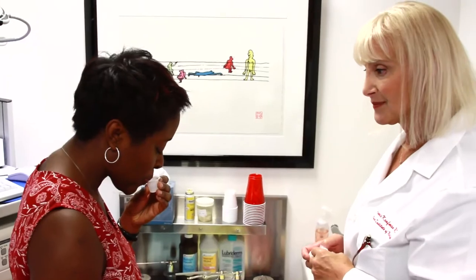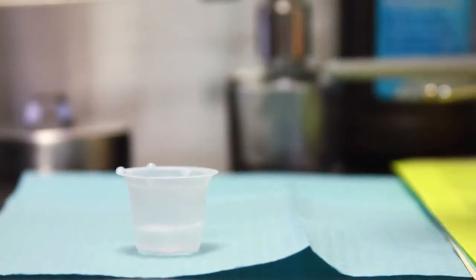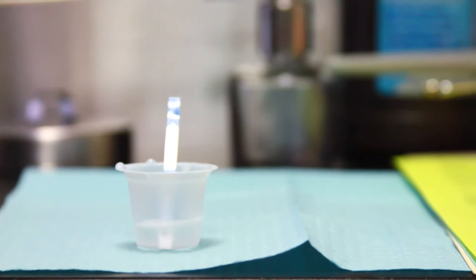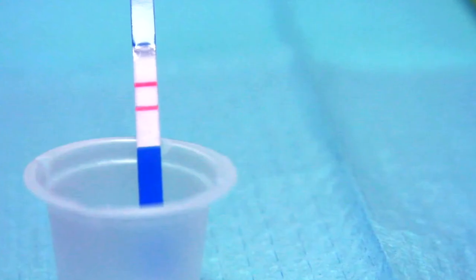The test is easy to perform. The patient simply spits into a small cup, and a test strip is placed into the saliva. The results are read within minutes.